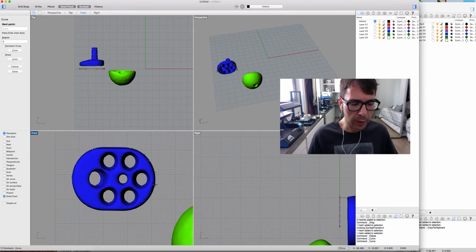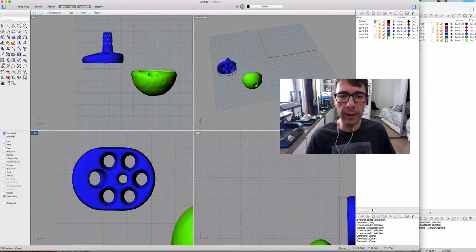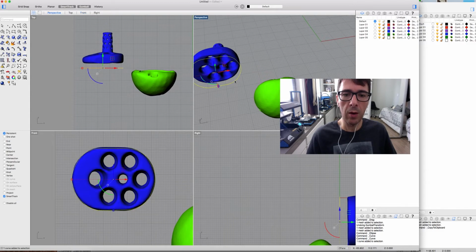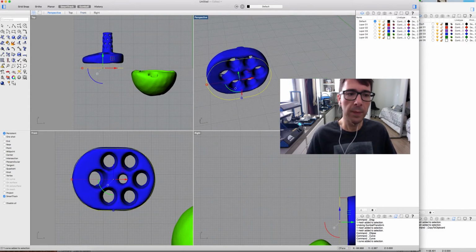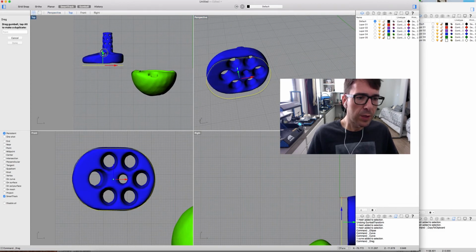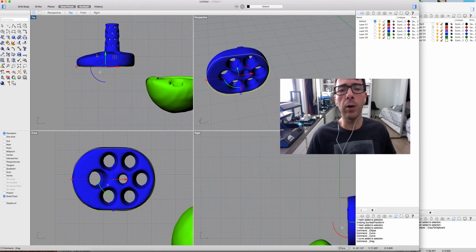So we are pointing and clicking over the implant here in the front view, as you can see. Point and click, okay, and okay. Now we have created here, as you can see, an oval line. Okay, here in the perspective you can see. Let's move this oval line just above our implant, and now we are going to extrude it.